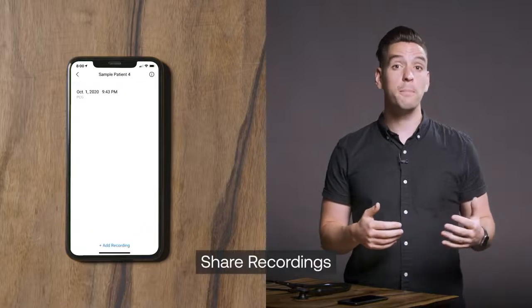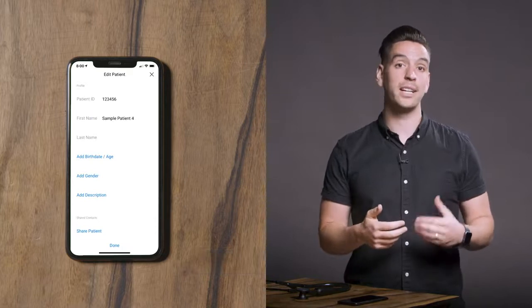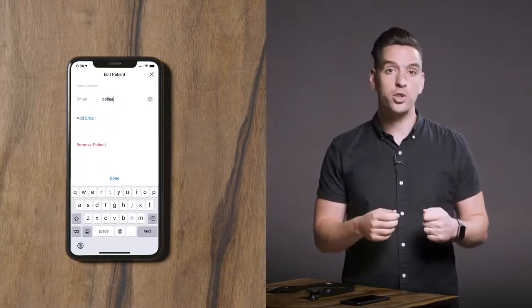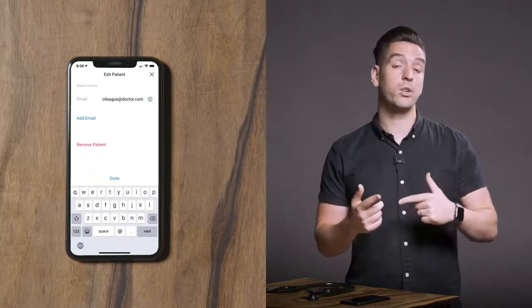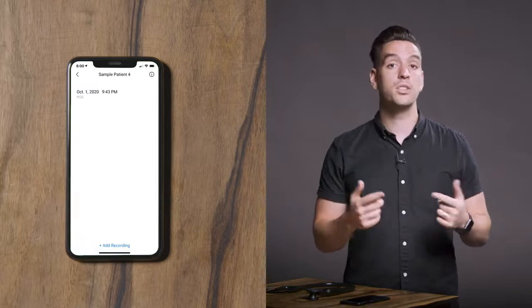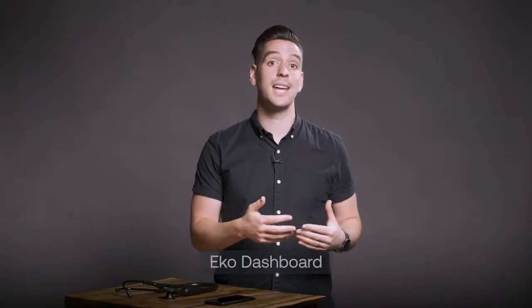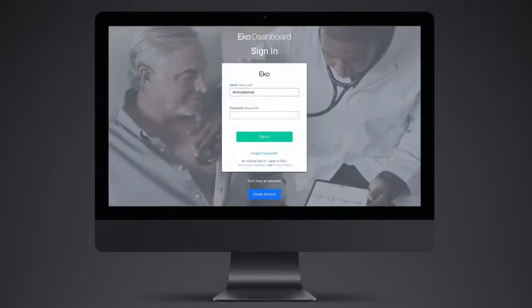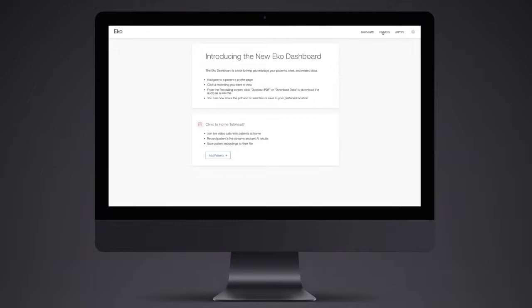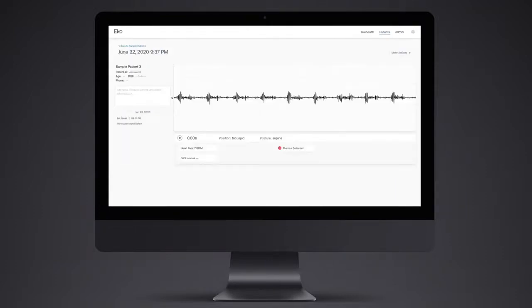To share a patient's recordings, go to the patient you wish to share and click on the information button in the upper right. Scroll down and click share patient. Simply enter the email address of the intended recipient and an email will be sent. The recipient will be directed to create a free Eko account to securely view the data. All data stored on the Eko mobile app sync to the connected dashboard. Using the dashboard you can do deeper analysis or download reports. Click on the dashboard button at ekohealth.com and log in with your Eko app credentials. Navigate to the patient's profile to view and select the recording you want to download. From here you can download PDF reports and the actual sound file.